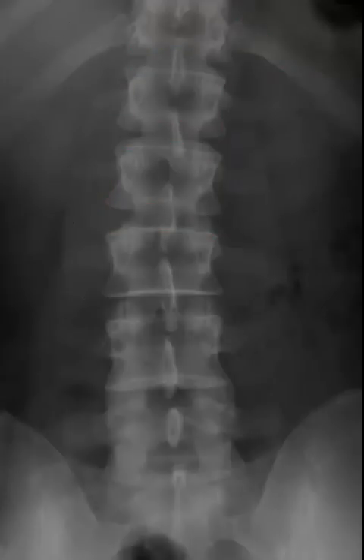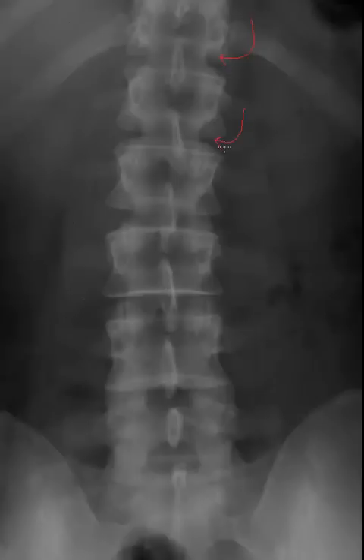Moving on: the intervertebral disc space is the lucent region visible between each intervertebral segment. Here are our pedicles, also known as the eyes of the spine. And here are our transverse processes extending off laterally.